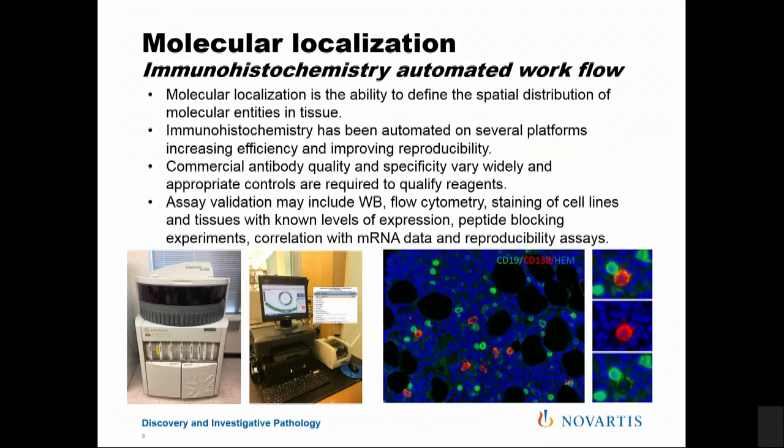Molecular localization is the ability, again, to define the spatial distribution of molecular entities like proteins or nucleic acids in tissue sections using tools like immunohistochemistry and in situ hybridization. And this allows the pathologist to begin to understand how alterations in the spatial orientation of these molecules ties to functional deficits in the animal.